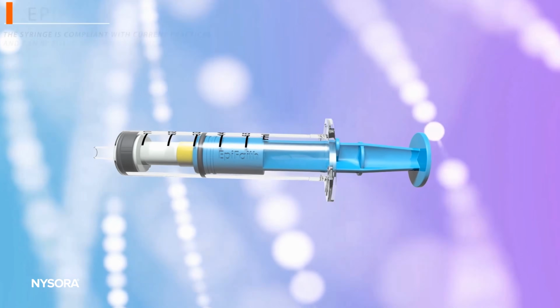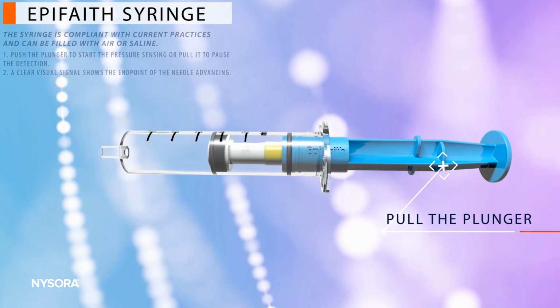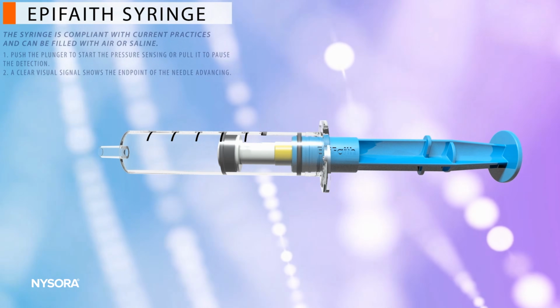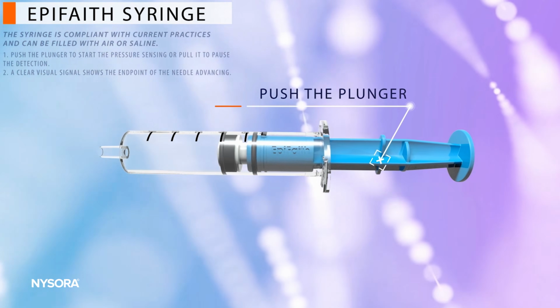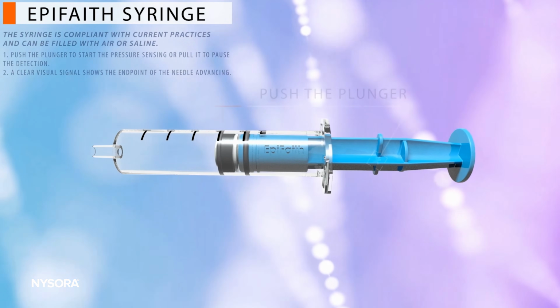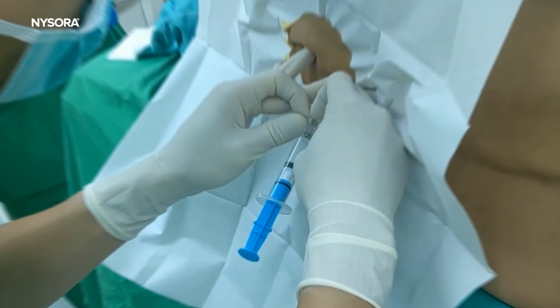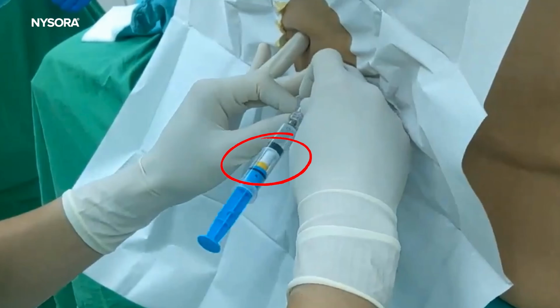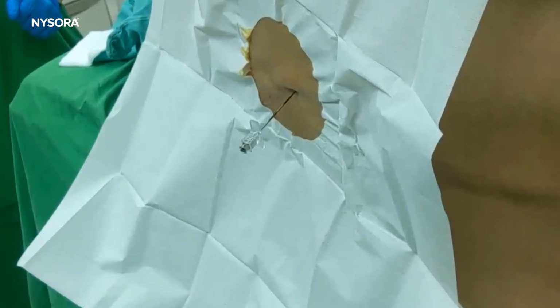In this video, we will review a potentially game-changing new epidural syringe that objectively streamlines epidural space localization. With the new syringe system that monitors the loss of resistance objectively during needle advancement, as the needle tip enters the epidural space, there is a sudden drop in pressure known as the loss of resistance. This triggers the activation of the color indicator ring, indicating to the operator that the syringe is now in the epidural space, even if the operator is unable to perceive that pressure change.